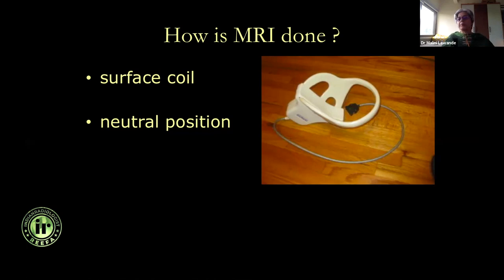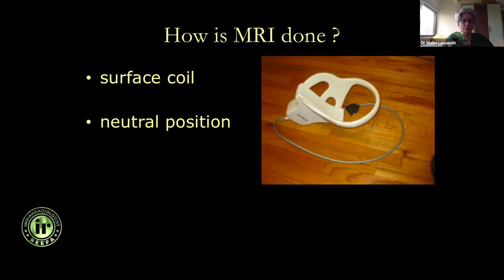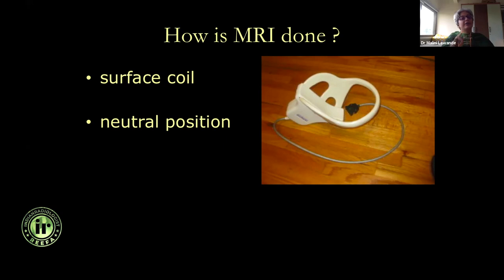Some people do arthrograms, but in our practice we have not done any arthrograms for more than a decade, because we are able to obtain very high resolution images. 3T is better for showing the labrum and cartilage, but even with 1.5 Tesla — which we have — you can get good images. It's very important to keep the field of view as small as possible to cover the shoulder. You cannot keep a large field of view and then zoom in, as spatial resolution is lost.